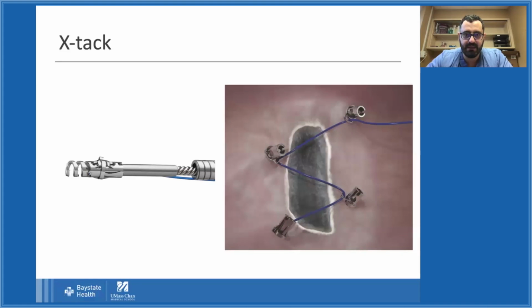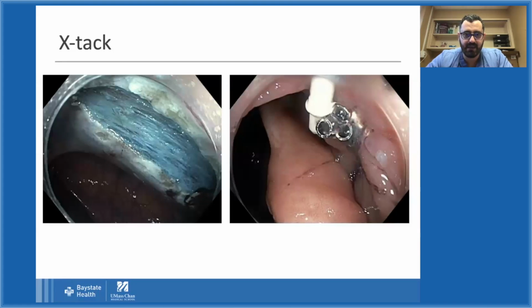Very cool technique. And then this is a picture from my colleague, Dr. Miller, who did the polypectomy on this patient, and you see this big defect, and this is how it was very nicely closed using X-Tack. Very cool.